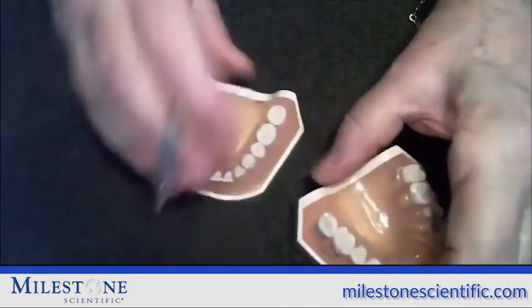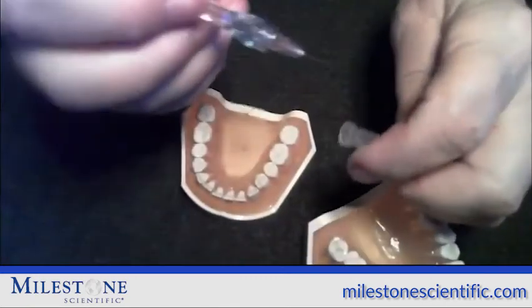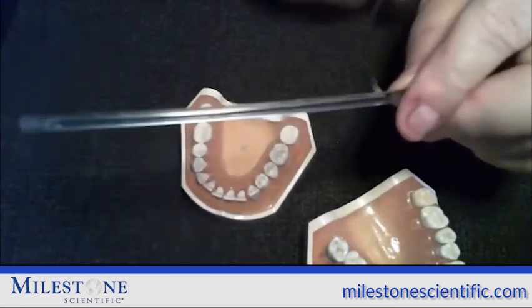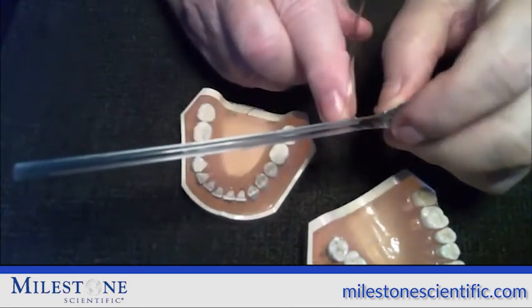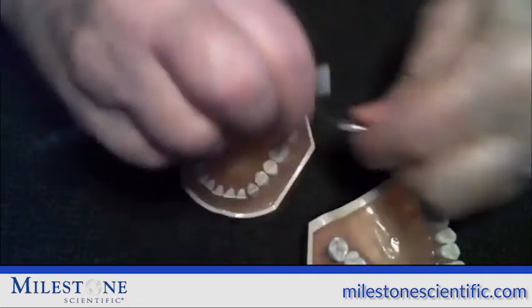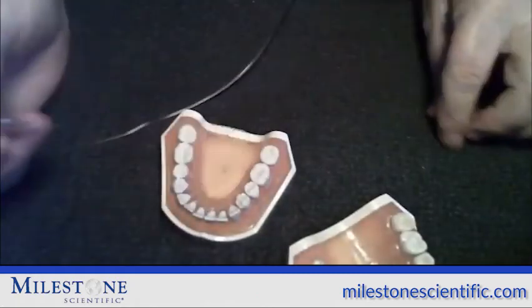On the lower, this handpiece is really too big to get into somebody's mouth. So what we do is we tend to break the handpiece short. As you can see, there's tubing that comes out of the channel in the handpiece. You pull that tubing all the way down, and you'll see a little notch about this area of the handpiece. Place the tubing away from you, and then just snap this short. Now you have a short-handled needle that gives you access anywhere in the mouth, okay?